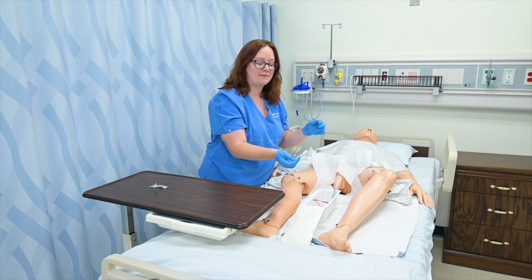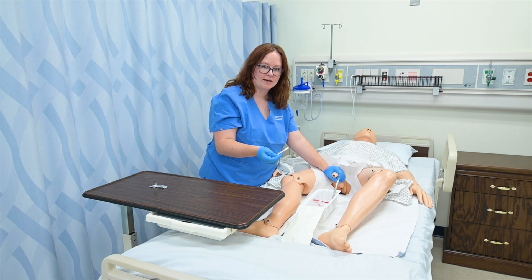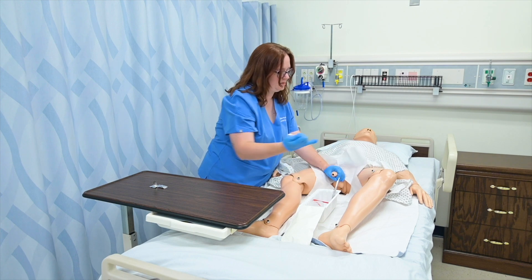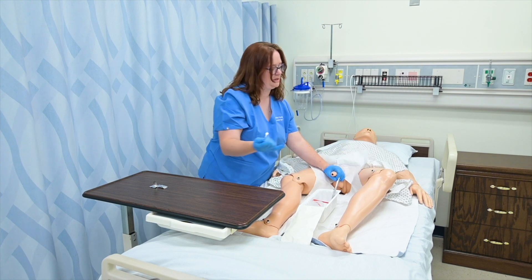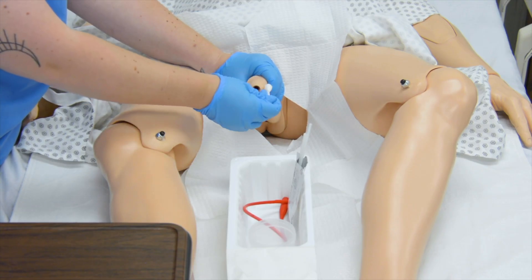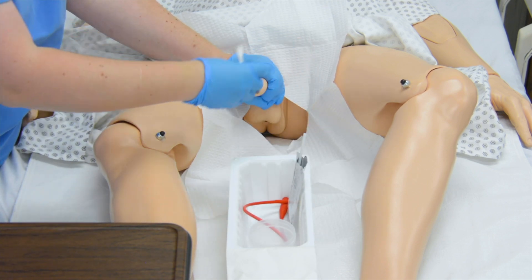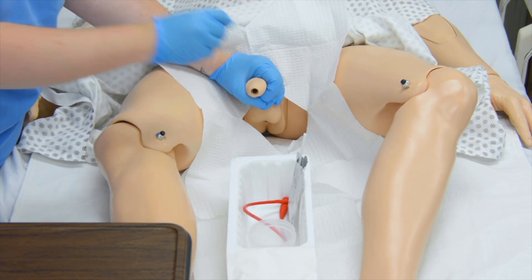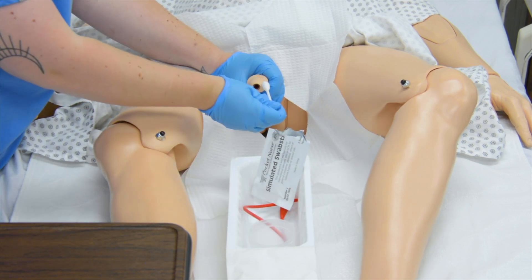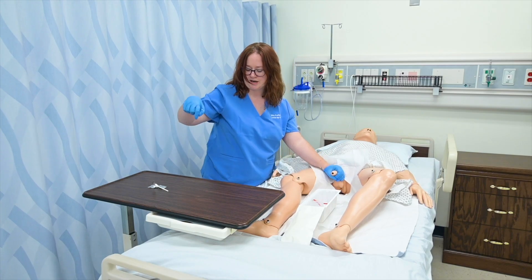I'm going to get my first swab stick and grab the penis, holding it at a 90-degree angle to the body. If he has a foreskin, I would of course pull the foreskin down to access the urethra. I'll use that first swab to do a circle and discard it. Second swab, another circle — drop that in the trash. And his third and final swab, drop that in the trash as well.